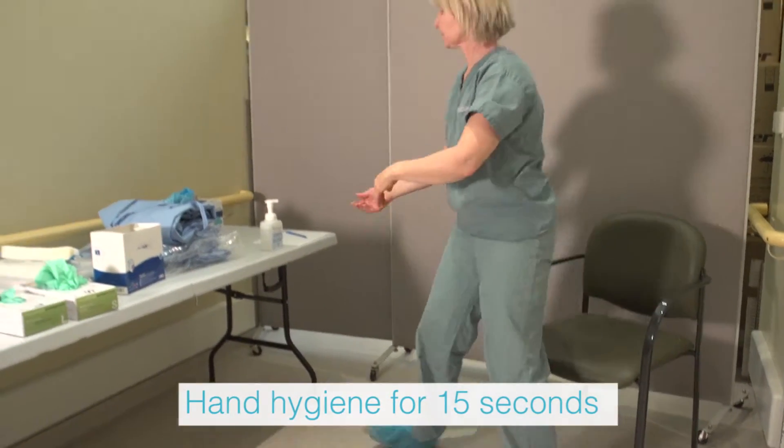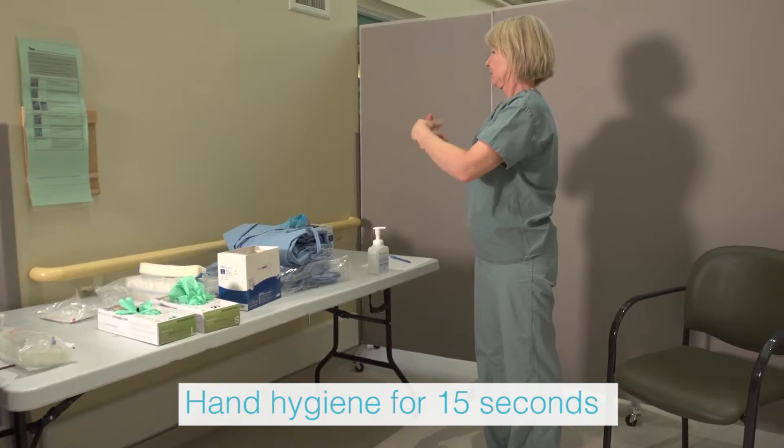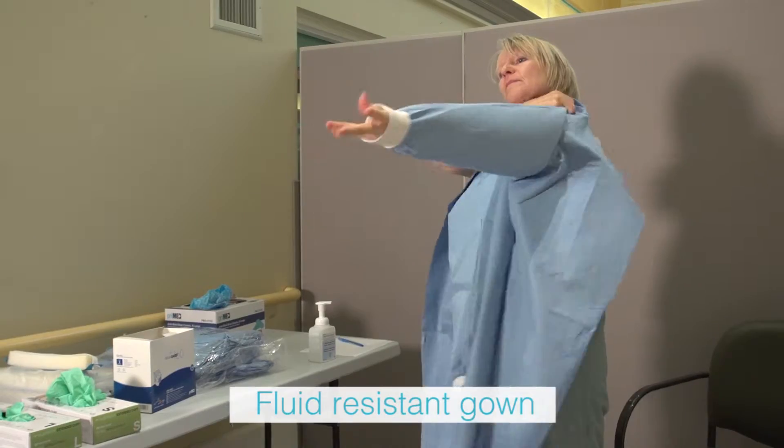Perform hand hygiene using alcohol based hand rub and allow hands to dry completely. Apply gown fastening at the neck and waist.